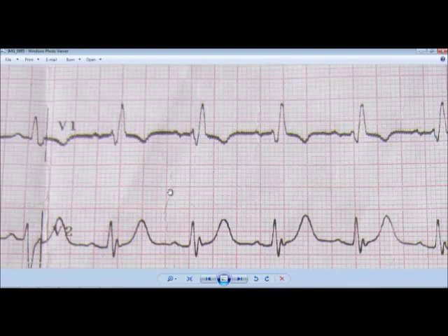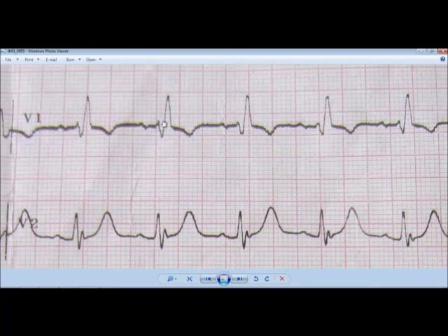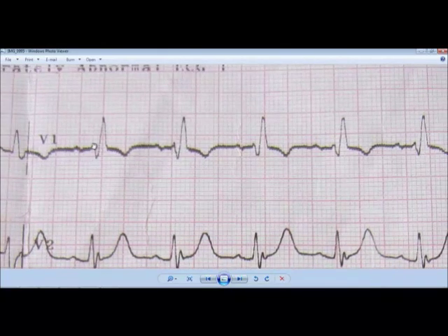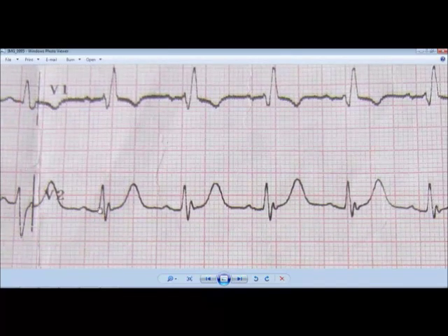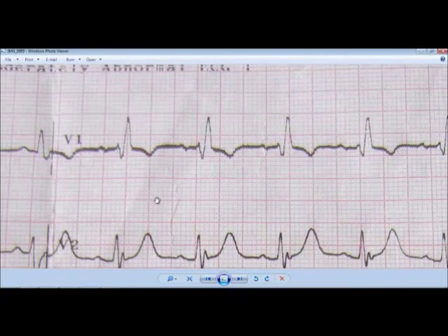Hello friends, this is Dr. Vinod and today I am going to show you an ECG of a patient with right bundle branch block. Here you can see a small R wave, an S wave and then again an R wave. This is an RSR prime or RSR dash wave. You can see it here also — a big R, then S and a small R. This is an RSR wave in lead V1, where the R wave primarily signifies the right ventricle.